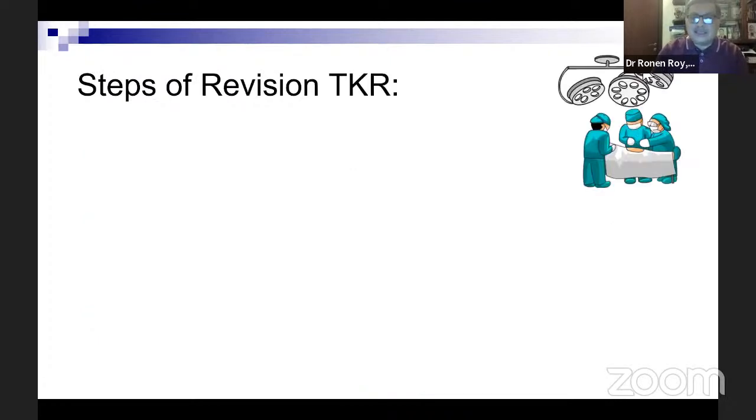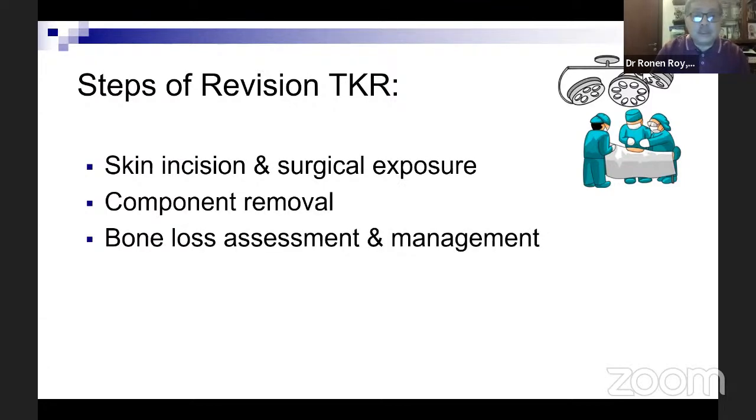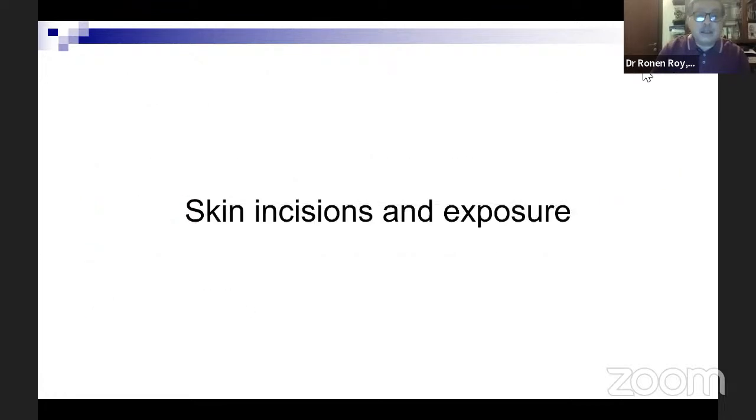So the basic steps of a revision TKR is what we're going to be looking at throughout this evening. We look at first the skin incision and the surgical exposure, removal of the components, bone loss assessment and management, balancing the gaps, and then finally choosing an implant. So let's first look at the skin incisions and exposure.